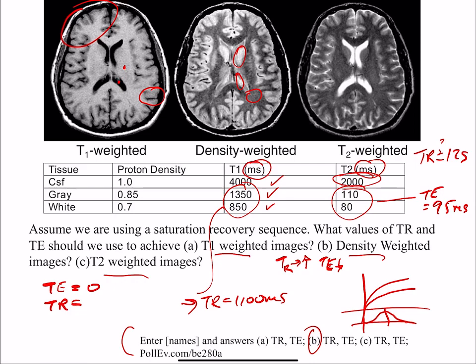So we'll talk about that a little later, but T2 is used a lot. They're actually all used and they give different information, and they have different responses to aging and disease. Because they're different, certain biological mechanisms may change one and not the other one. But it's all related, and so oftentimes you'll get all three and then try to model the whole system.